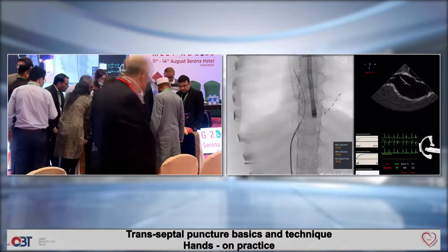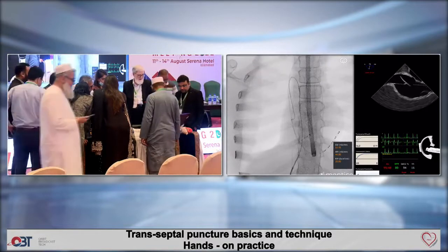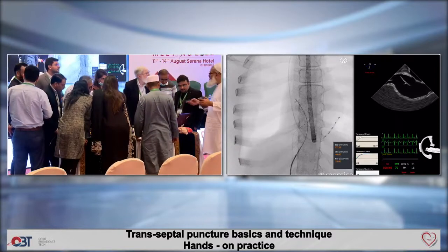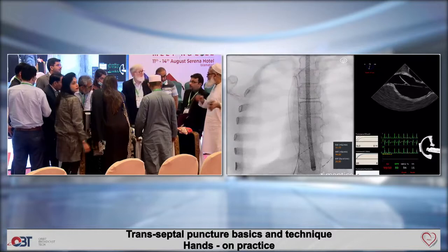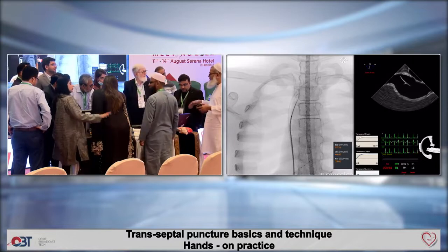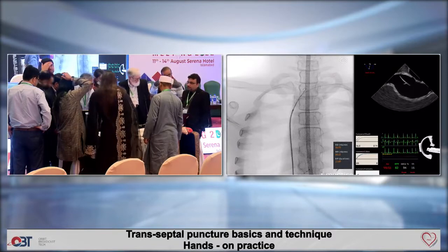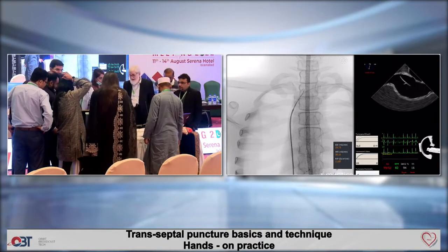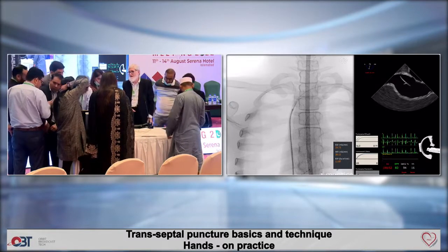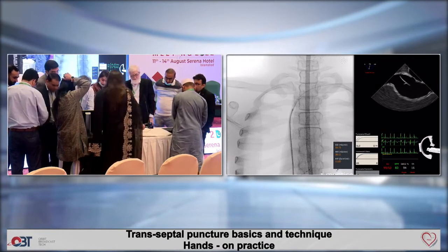रिलैक्स होकर आराम से करें. बस ये नहीं, ये लूप के साथ नहीं जाना चाहिए. इसके साथ ऊपर करें ना सर, शीट ऊपर करें. बस ये ठीक है, चला गया. ठीक है, अब होल्ड करें, बस सही है. अब ये वायर, जब तक ये वायर नहीं निकलेगा, इसमें नीडल पिक नहीं करेगा. ये वायर निकलेगा फिर जो है, असल में ये तो ऑलरेडी पहले से हो. अब हम ये डाल देंगे.